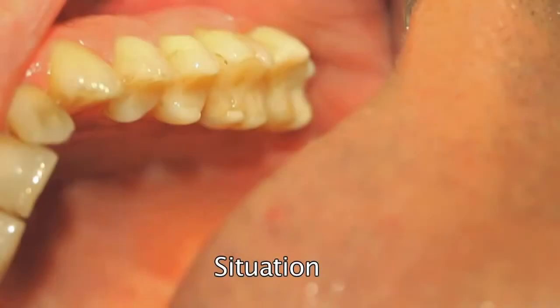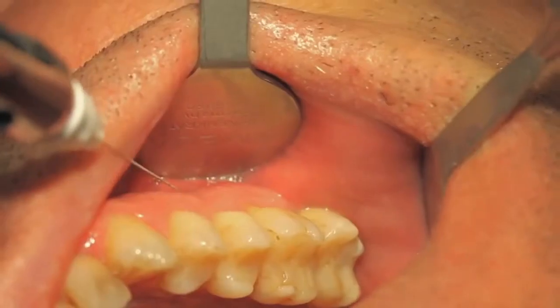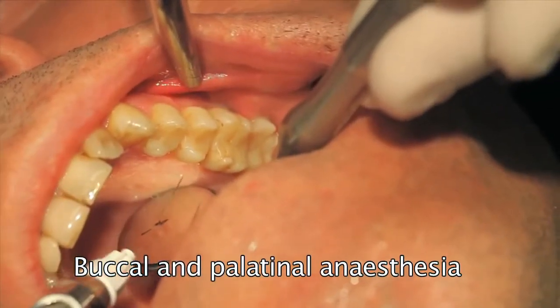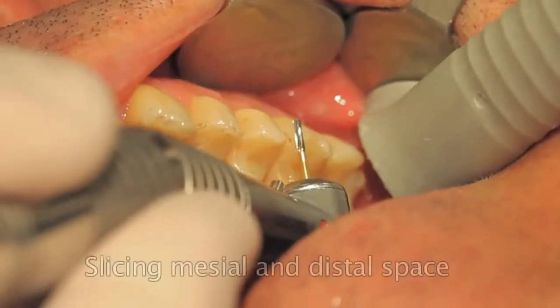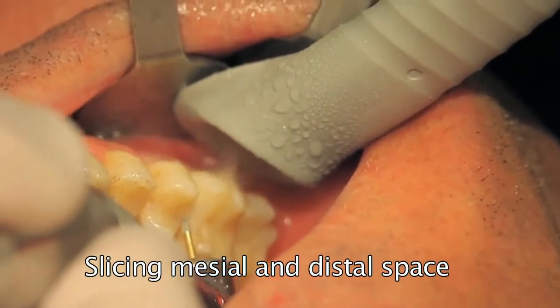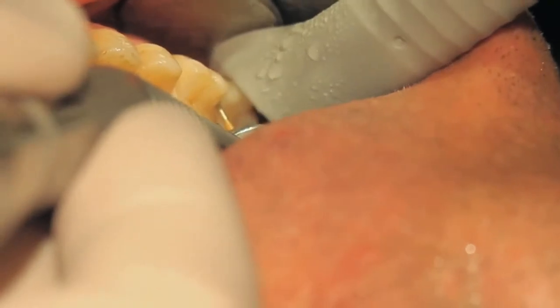A clinical case: the first molar must be removed due to endodontic problems. Following anesthesia, a proximal slicing is necessary for intra-alveolar laxation, which must be done immediately after anesthesia, because the periodontal fibers will continue loosening with time.